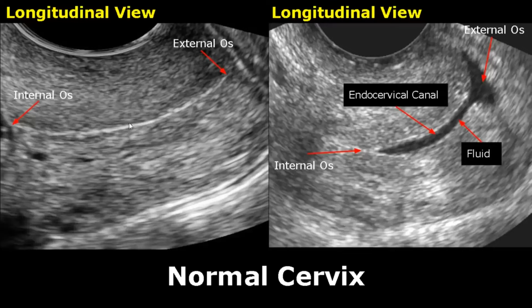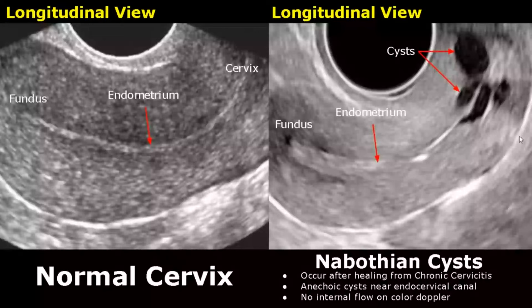The internal os is the junction between the body of the uterus and the cervix — it is the upper part of the cervix and will be seen on the left side in the image. The external os is the junction between the cervix and the vagina, seen on the right side. The area between the internal os and external os is the endocervical canal. In this image we can see some fluid in the endocervical canal.